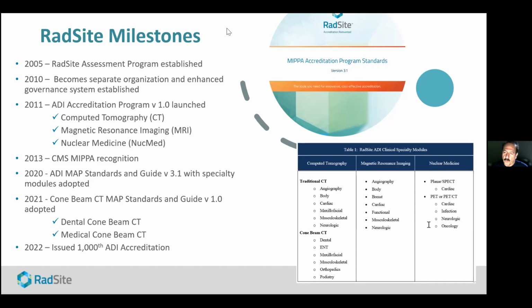We're seeing more and more utilization of CT technologies, and a lot of the work that I do is in artificial intelligence, where we're looking at having AI enhance the images, decrease noise, and also help with regard to diagnosis. One of the challenges that we have for cone beam CT is, depending on how one does an acquisition, obtaining complete information.